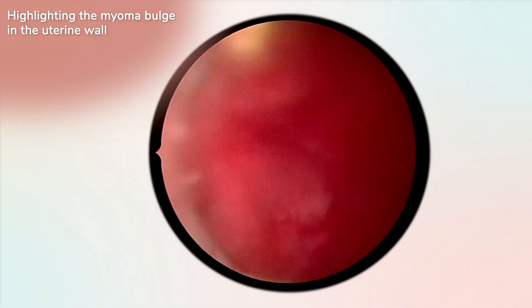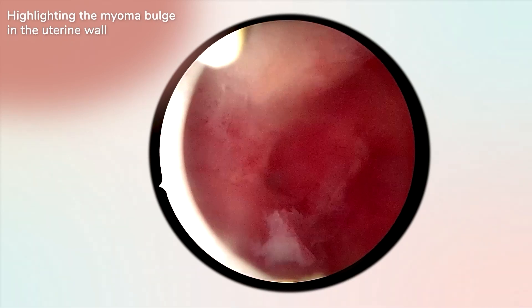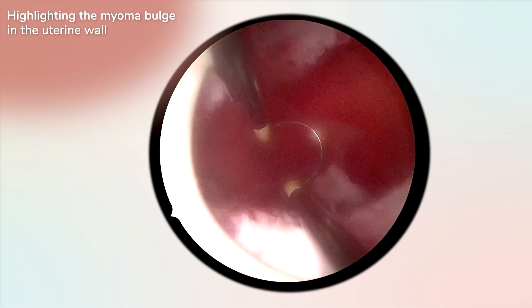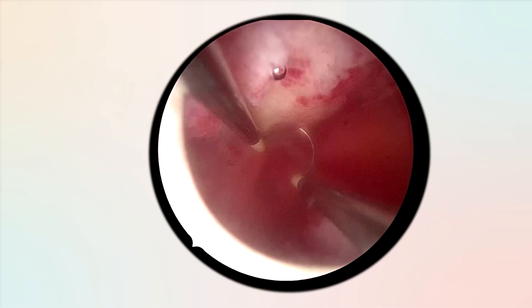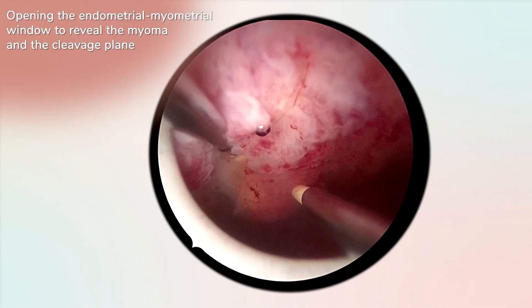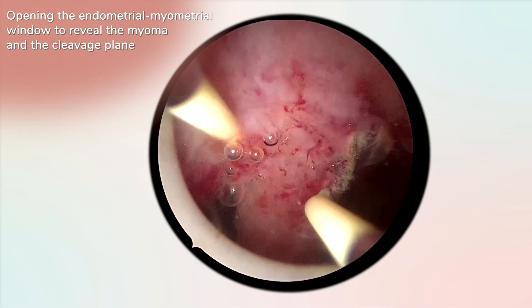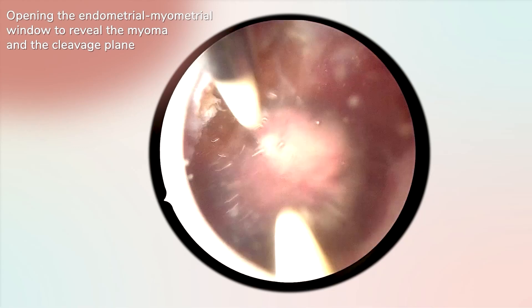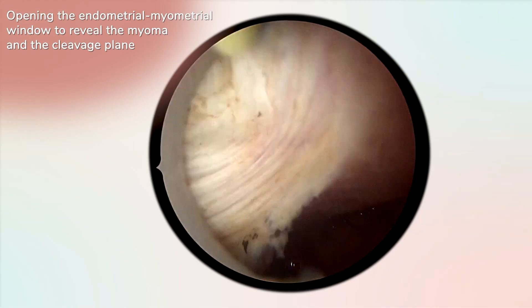To confirm the presence of a type 3 myoma, it is necessary to reduce the endocavitary pressure and then return it to normal distension. This procedure should allow for the identification of a bulge in the uterine wall, in this case the anterior uterine wall.